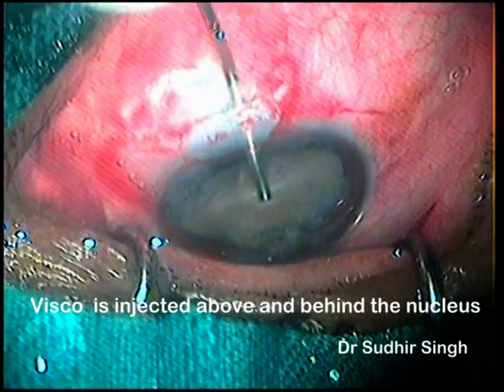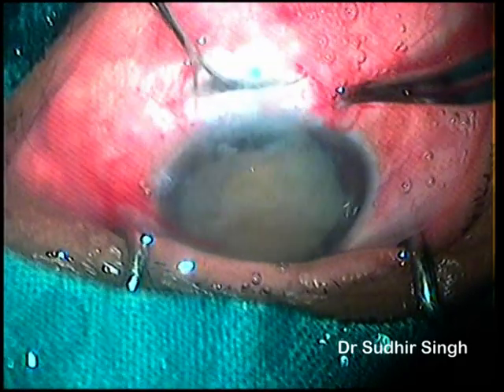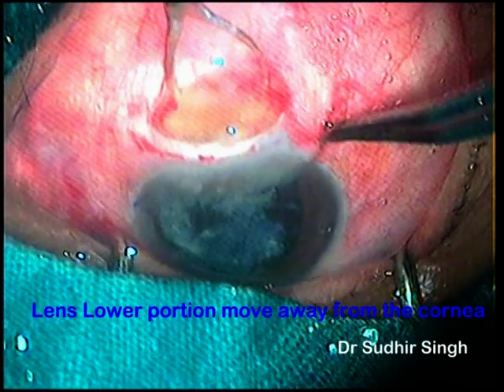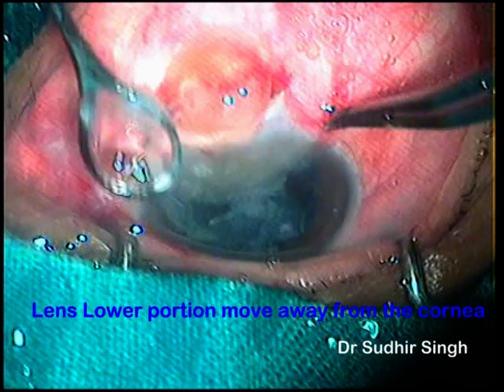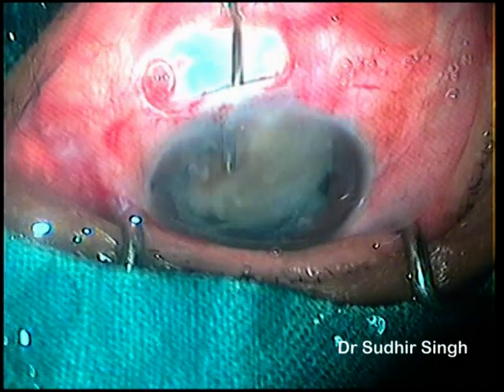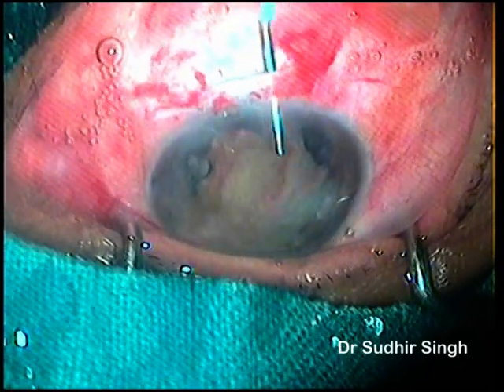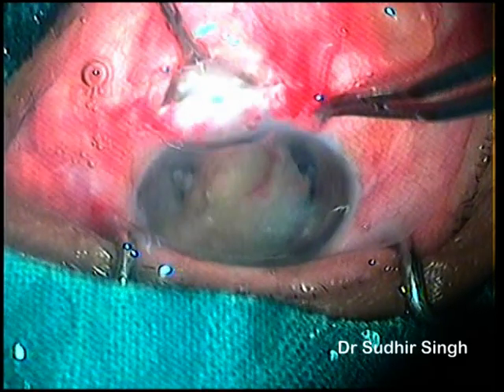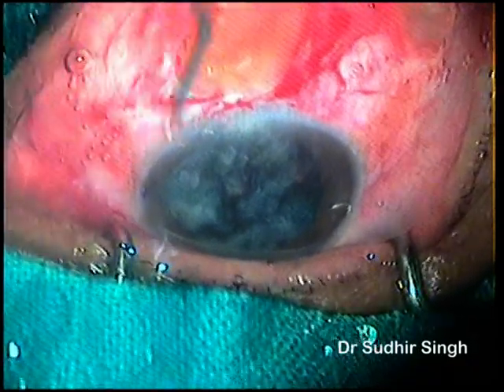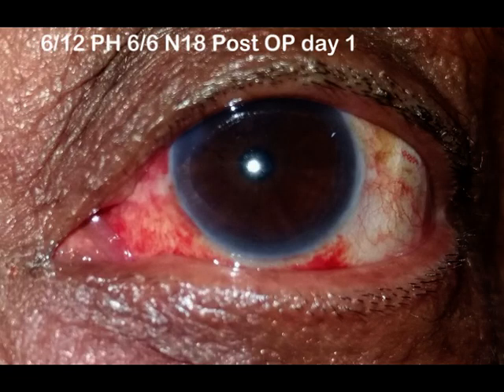Please watch this 6 mm intratunnel phacofracture nucleotomy surgery clip in slow motion to understand better. I hope this video is helpful to understand the intratunnel phacofracture manual small incision cataract surgery basics.